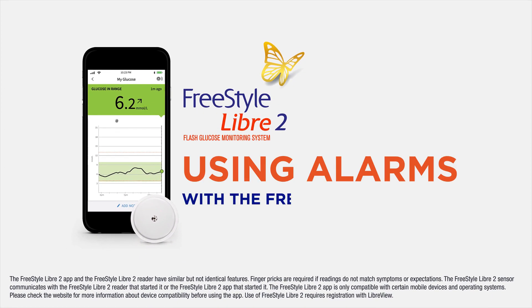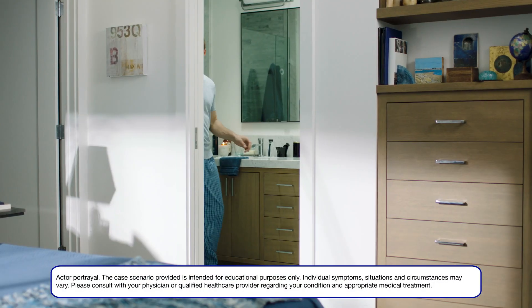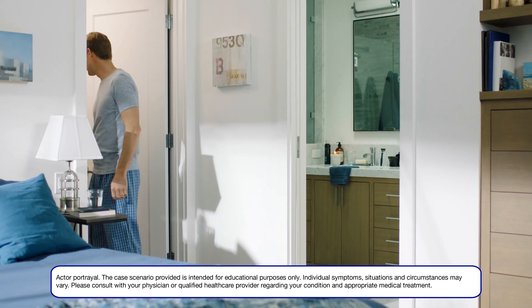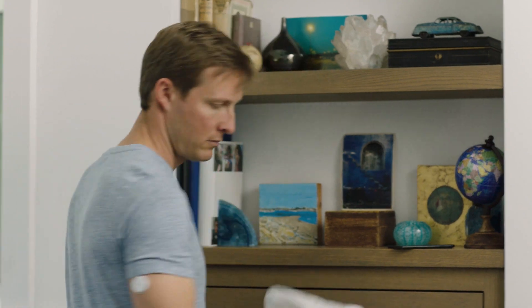This video will show you how to use alarms on your mobile phone with the Freestyle Libre 2 app. I was excited to learn that my Freestyle Libre 2 system gives me the option of using glucose alarms to let me know when my glucose is high or low. Using the alarms can be a helpful way to better manage my diabetes.